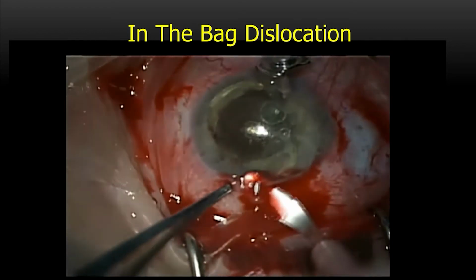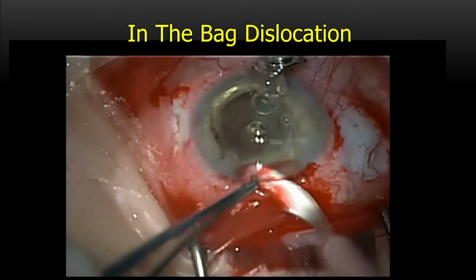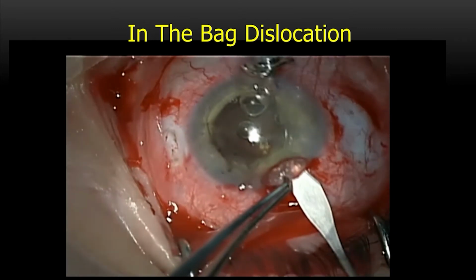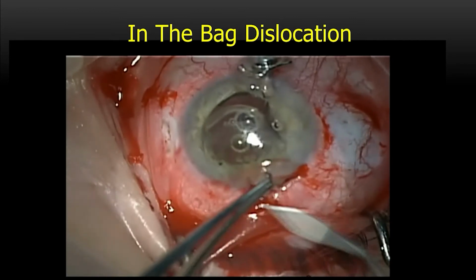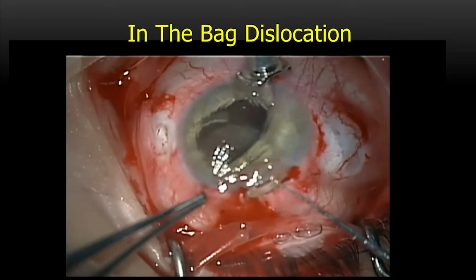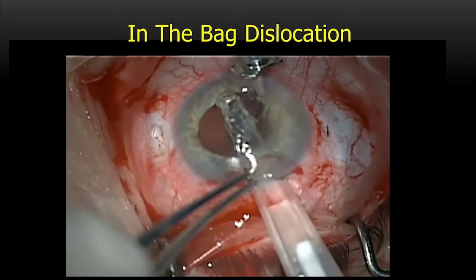The L-shaped incision is created, and then a crescent blade is used to dissect into the cornea and sclera such that an internal opening of 6mm is created. The IOL bag complex can then be easily extracted through this incision, and the new lens can be introduced.